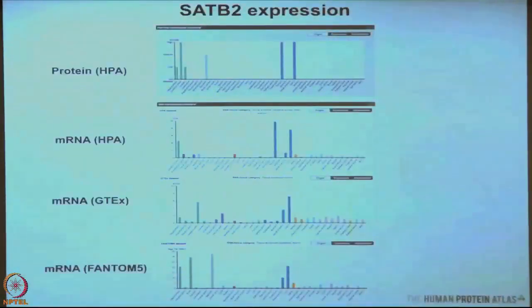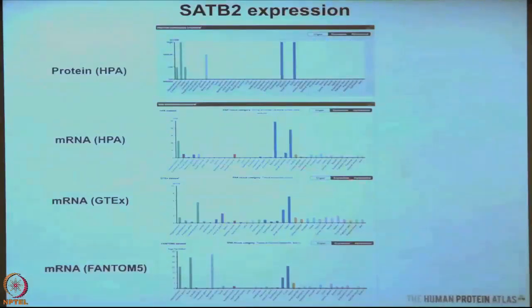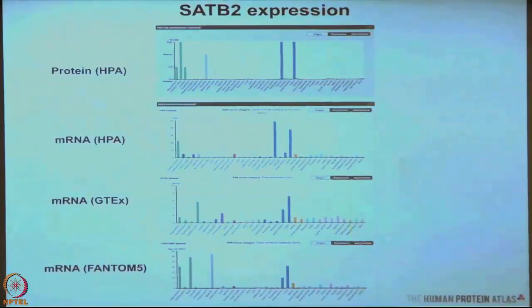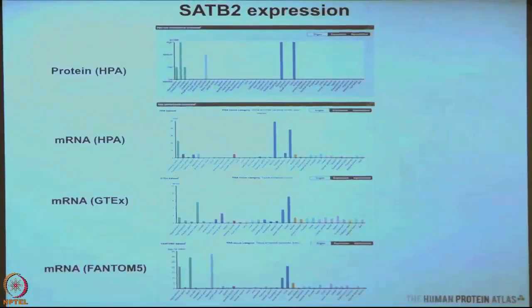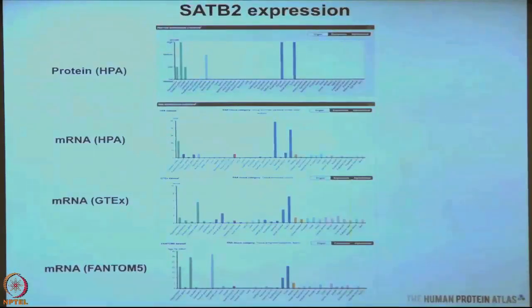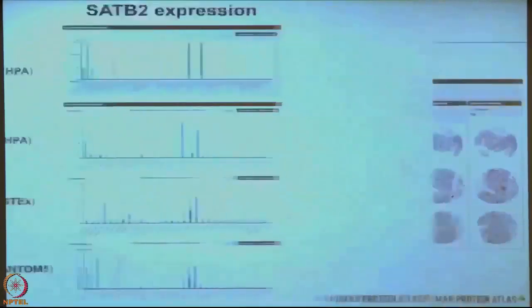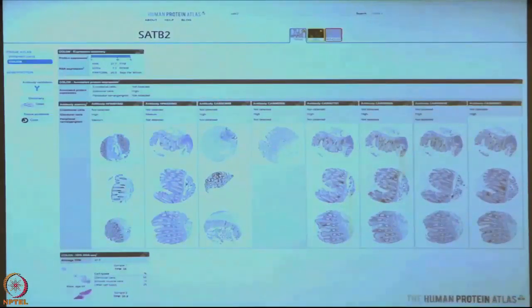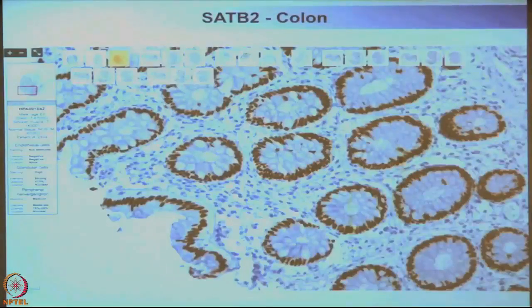One can look at the data in more detail — protein data as bar diagrams and our RNA sequencing data. We have also imported for all genes data from the Broad Institute GTEx project, RIKEN, and the Fantom 5 project. There is very good consistency across different platforms and specimens, giving a lot of validity to the expression data on the Protein Atlas. At the deepest level you can go into high-resolution images and look for yourself where SATB2 protein is expressed — in the nucleus of glandular cells in colon.